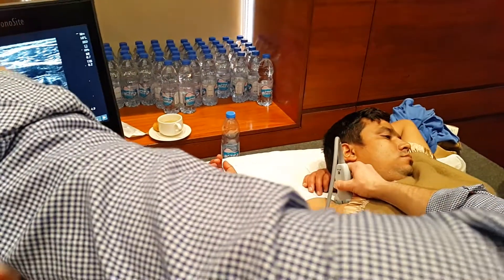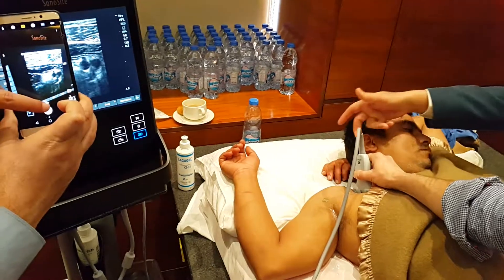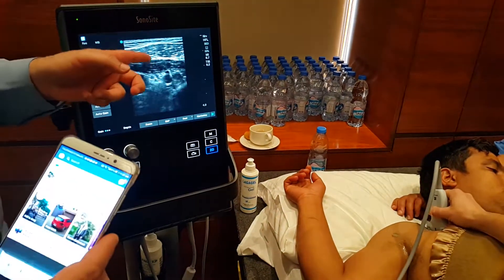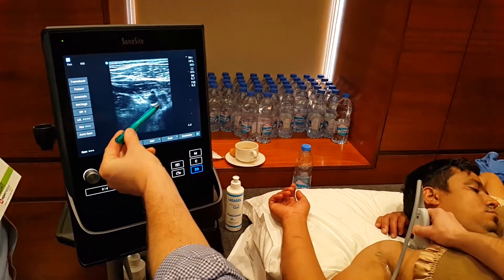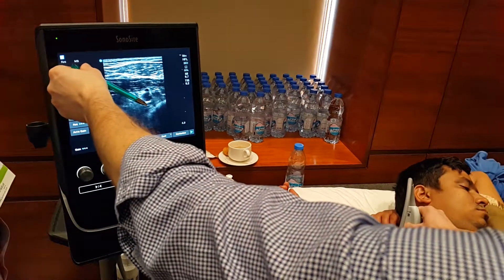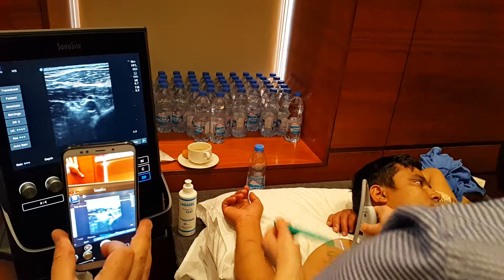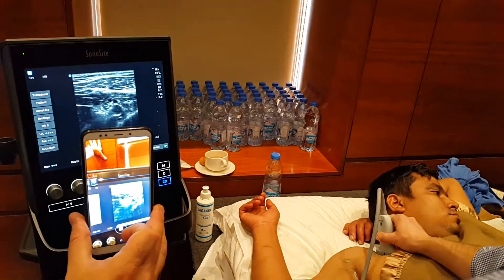Our needle is going to come in from this direction. We aim to get local anesthetic to spread underneath the artery and around the artery. So our catheter we will put into here — the catheter goes this way, coming in like that, underneath the artery.